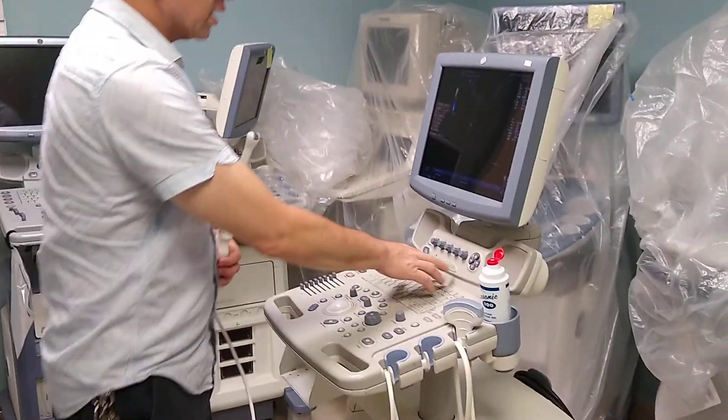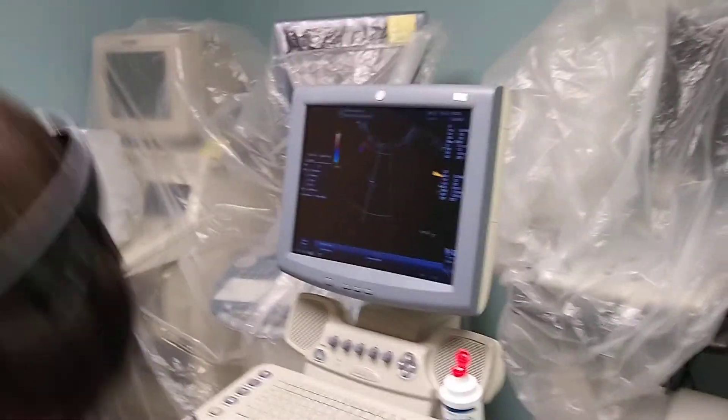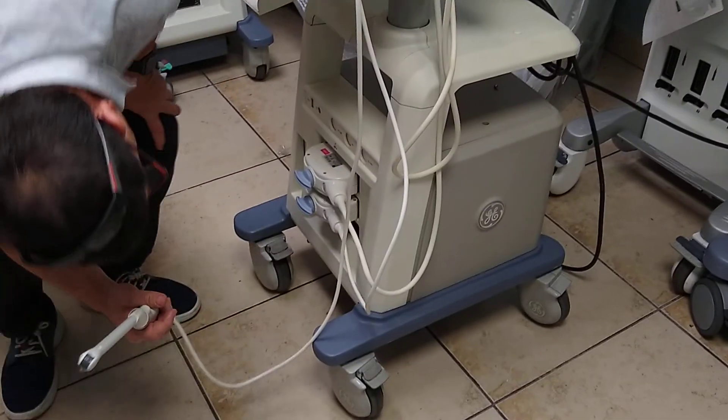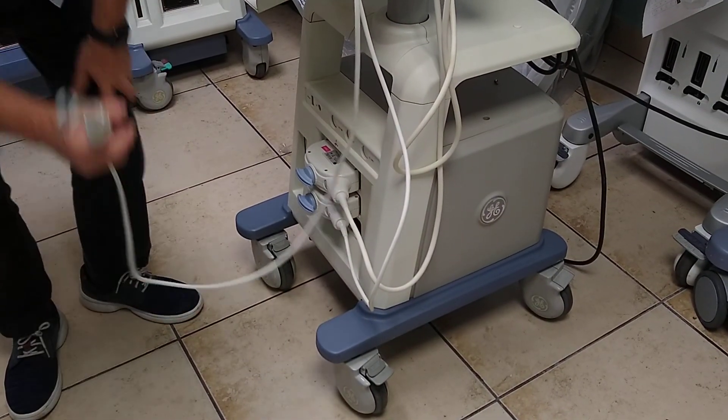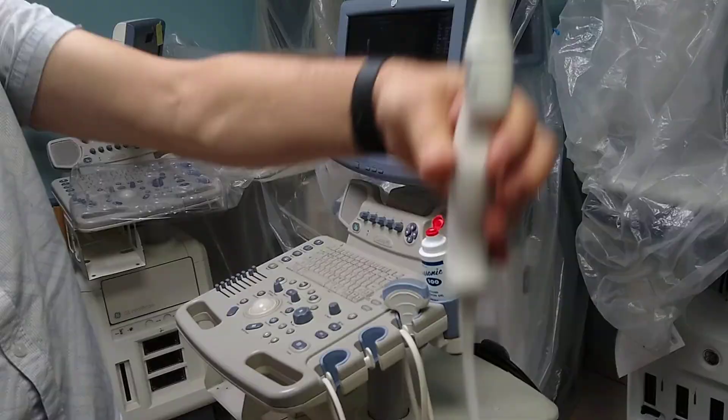We are going to test this Logic P5, which is the 156-113, with these two transducers. The third one is the vaginal one, which I consider the 158-07. The lens is in very good condition, the transducer is like new.